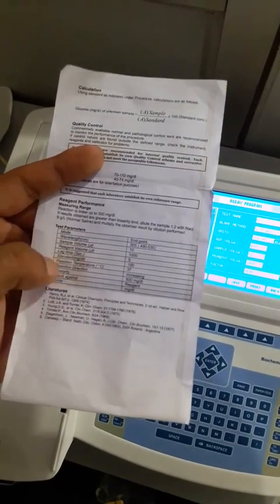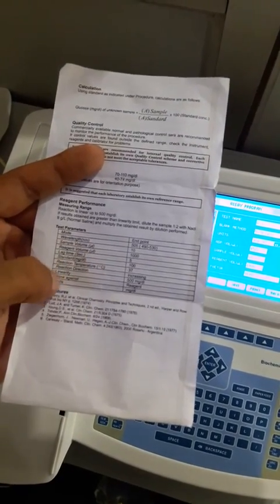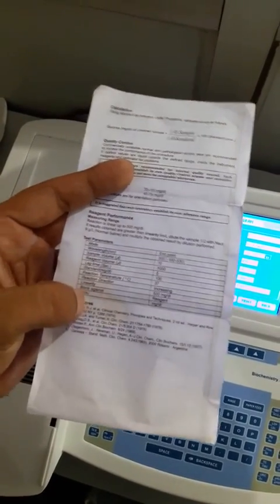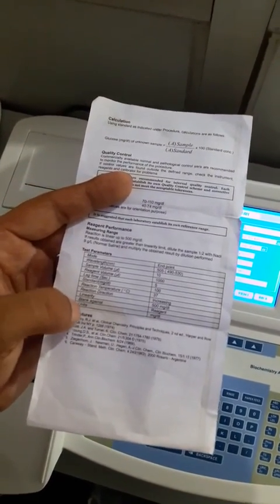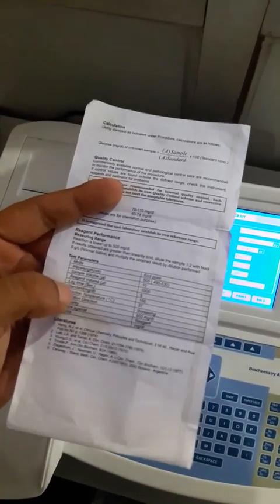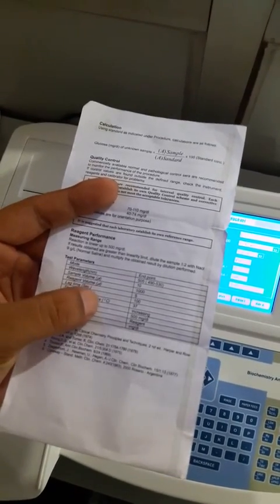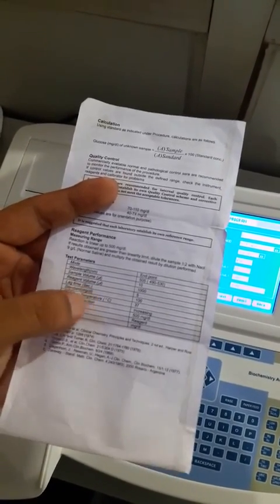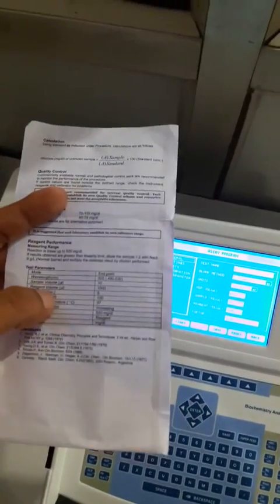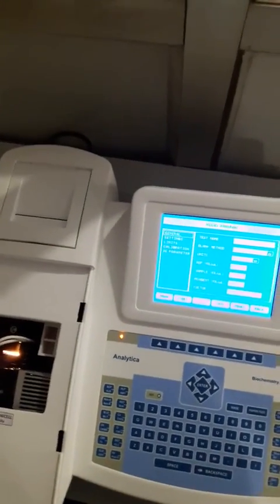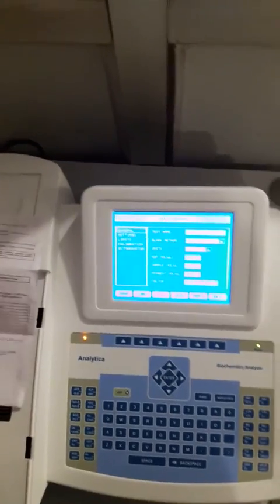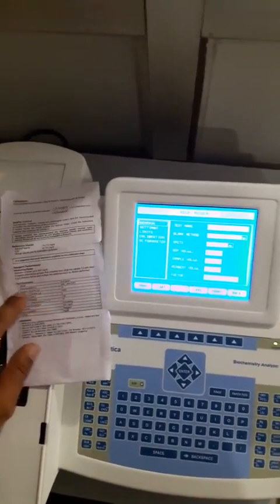This is the literature: the mode is End Point, wavelength is 505, sample volume, reagent volume, linearity, lag time — everything is given. The unit of the reagent is mg/dL, so we have to use the unit mg/dL as well. The concentration is given as 100, so the standard value of concentration is 100 and we have to enter that value also.